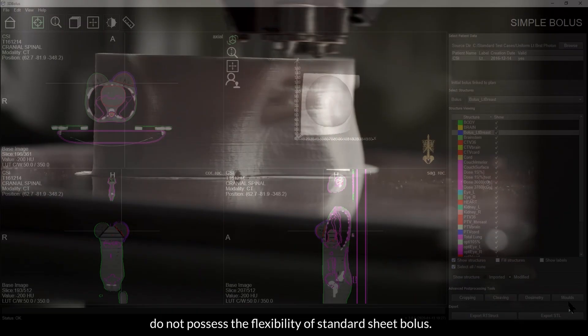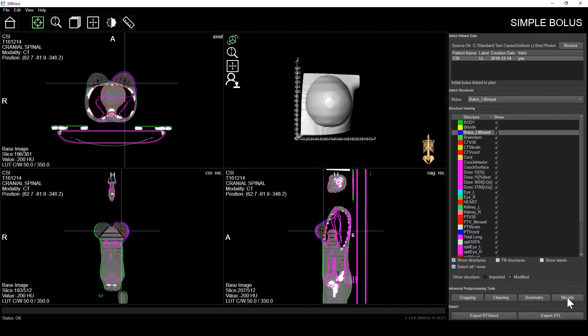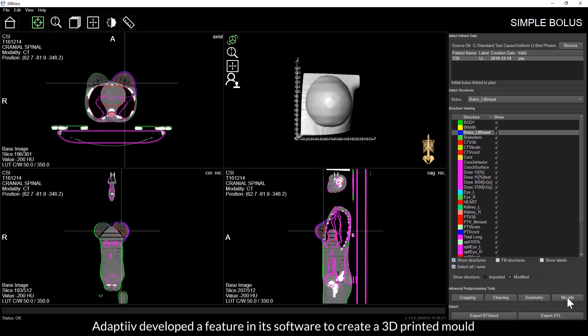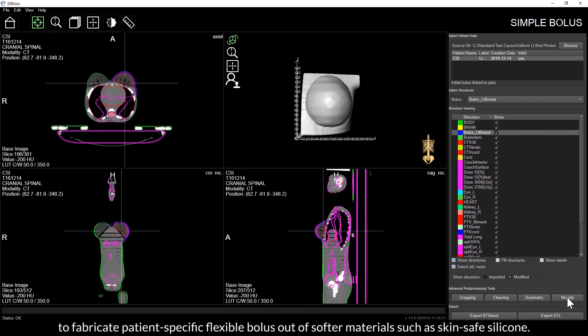To provide users with a soft, flexible bolus option, Adaptive developed a feature in its software to create a 3D printed mold to fabricate patient-specific flexible bolus out of softer materials such as skin-safe silicone.